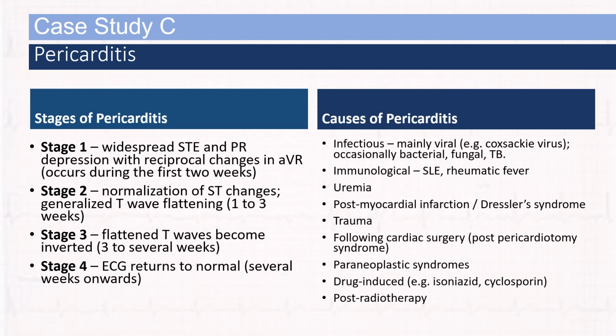It is interesting, however, that the EMS provider does not know what stage a person may be in unless they have told them that they have just recently been diagnosed with pericarditis and when the symptoms started. So you need to be mindful of all EKG changes which may not appear normal and clue you into an issue that may be occurring with the cardiac system.